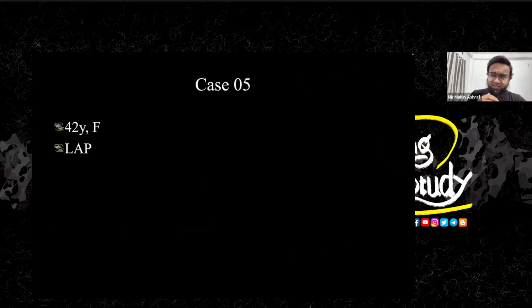So now come to case number 5. So it's a 42-year-old female patient. So fortunately, we are getting a female right now with a low abdominal pain. So let's see what we can get on ultrasound.